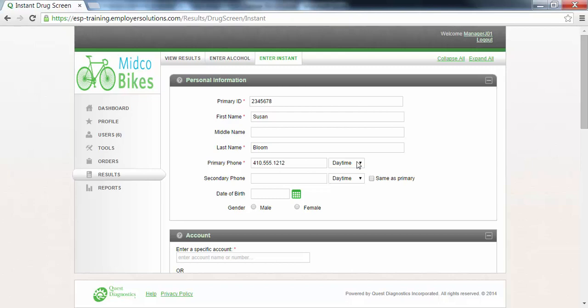Even though the middle name, secondary phone, date of birth, and gender are not required, you may want to use these fields if the information is helpful.